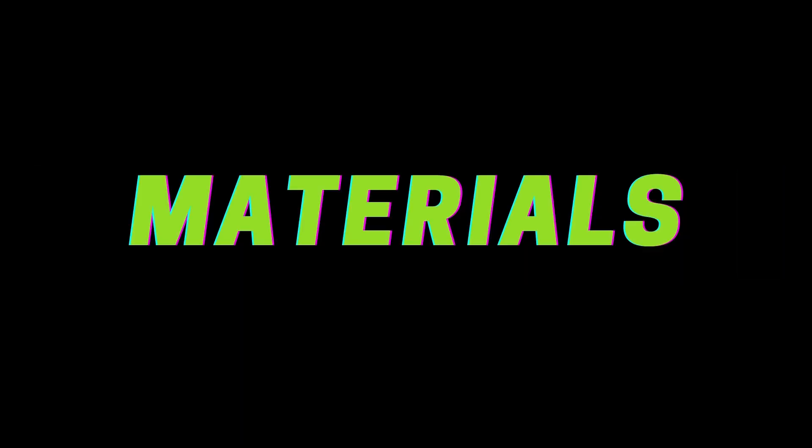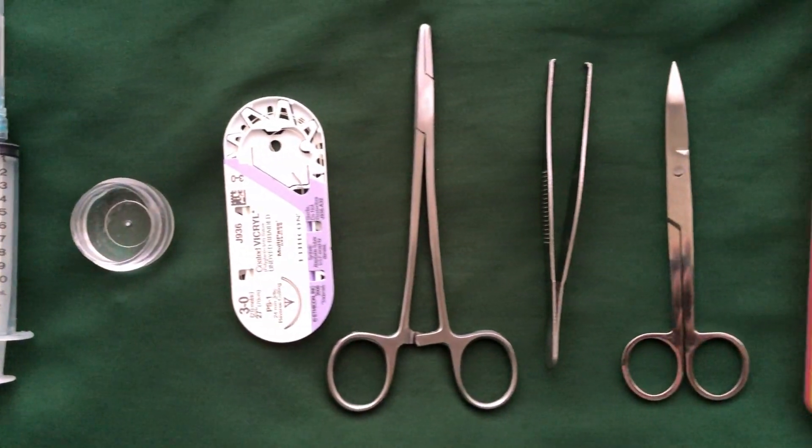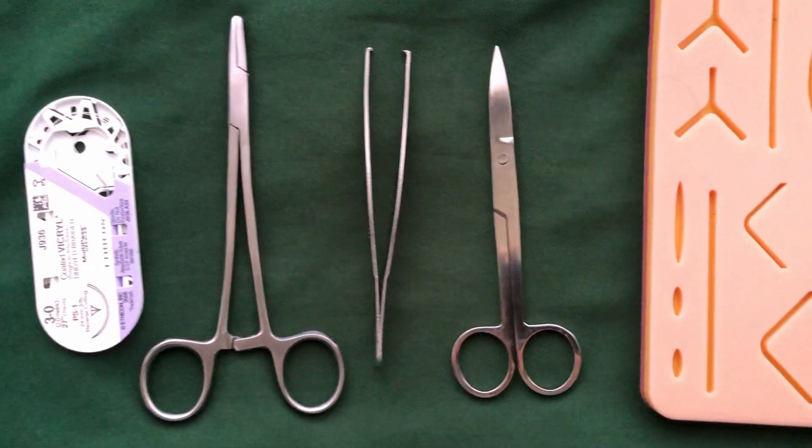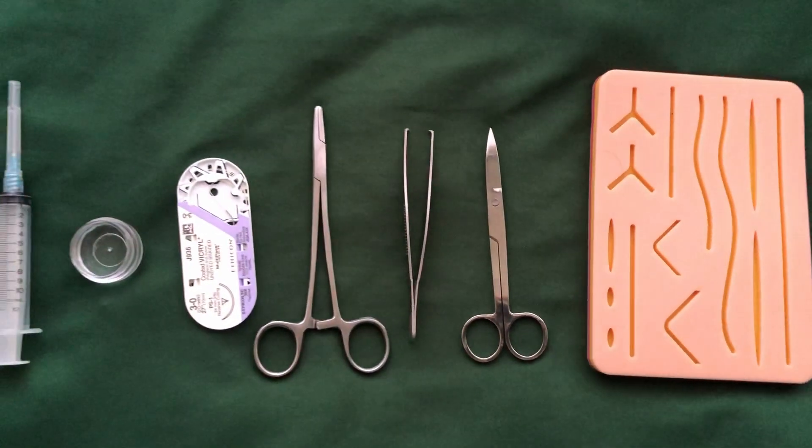For the materials, you will be needing a syringe, local anesthesia, sutures, needle holder, pickup forceps, surgical scissors, and a surgical pad or an alternative.